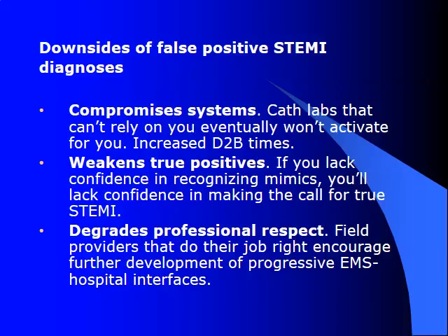They thread the catheter up into the aorta and into the coronary circulation. They put dye in there, a radiographic dye, and they look at it. They're able to see the coronary arteries with that dye on a radiographic screen. It's kind of like a real-time X-ray machine almost. So they're able to see that dye flow through the coronary arteries as they inject it into the aorta, and then they are able to see where a clot is located that way.